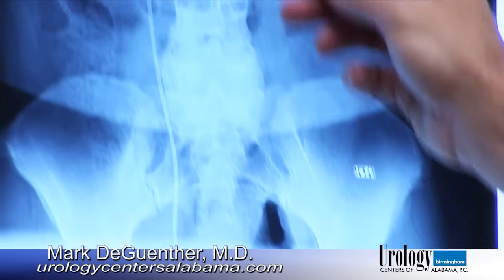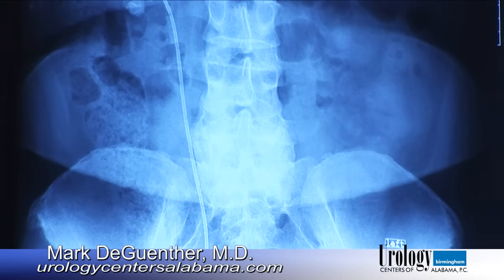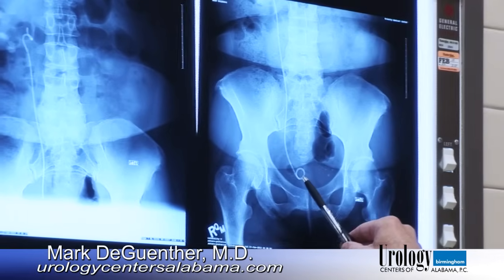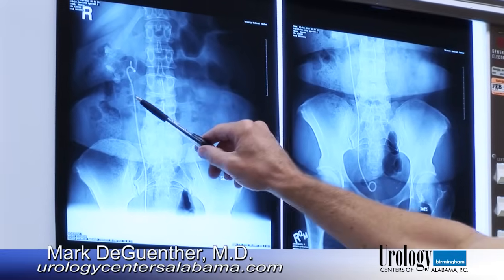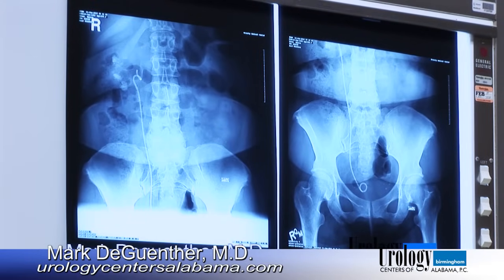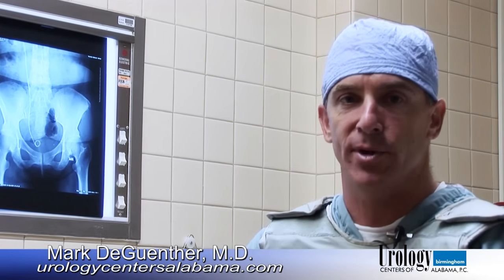This is a stent which had been previously placed. A stent is a hollow plastic tube which goes from the bladder — you can see the curl down here in the bladder — all the way up to the kidney. A stent is used to prevent the urinary tract from being obstructed by large stone fragments. Sometimes a stent is necessary during a lithotripsy, as we call this procedure, and sometimes it is not.